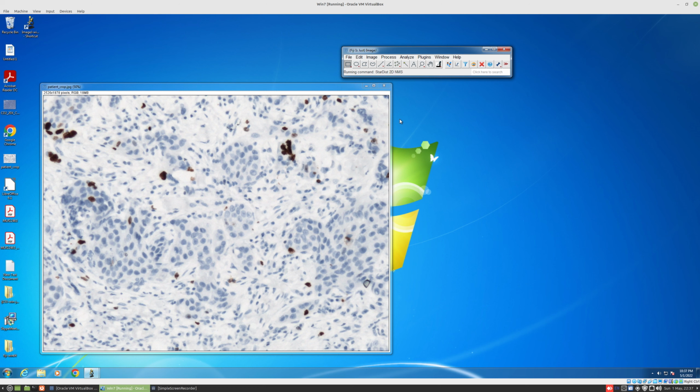So the next time, if needed, you won't need to re-segment if you reopen the software a bit later on. You can automatically get this segmentation. As I said, it's not fast, but it's very precise.